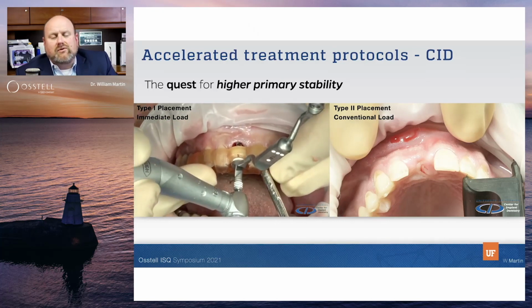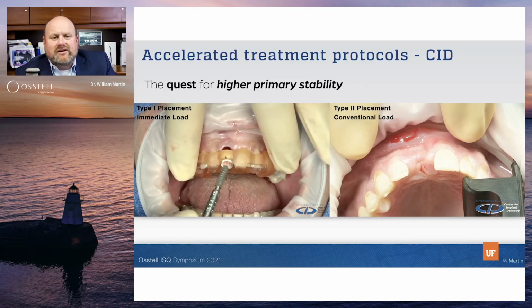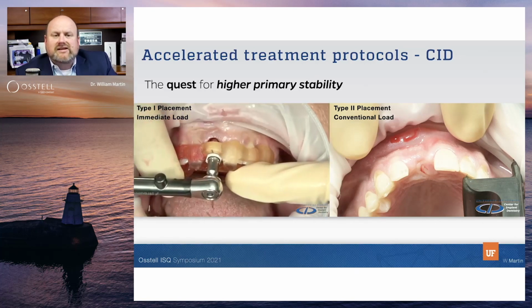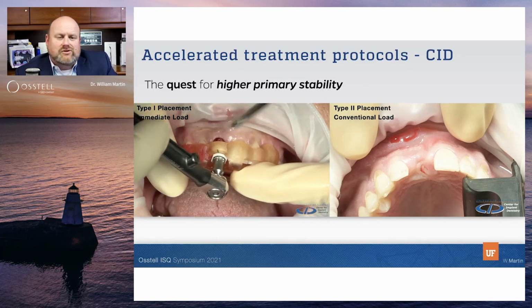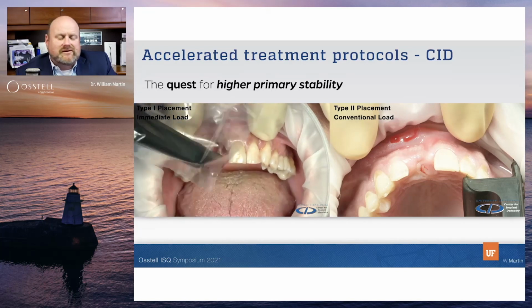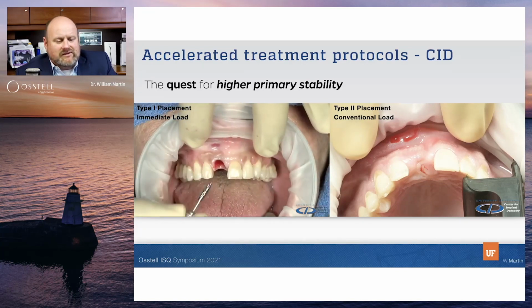Okay, so we can go into surgery planning for immediate loading, but if we don't have the stability achieved that we seek, then we're going to submerge that implant or go with a custom healing abutment, but we're not going to put that implant in function.